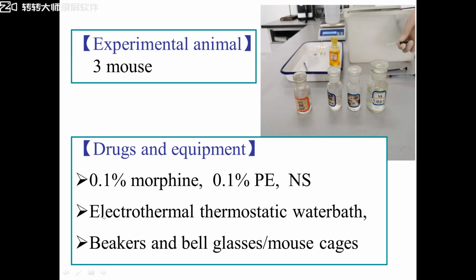Okay, but in this method, we will use a hot plate. So we use a thermostatic water bath as the hot plate, and also use some injectors and beakers. Okay, let's do the lab.